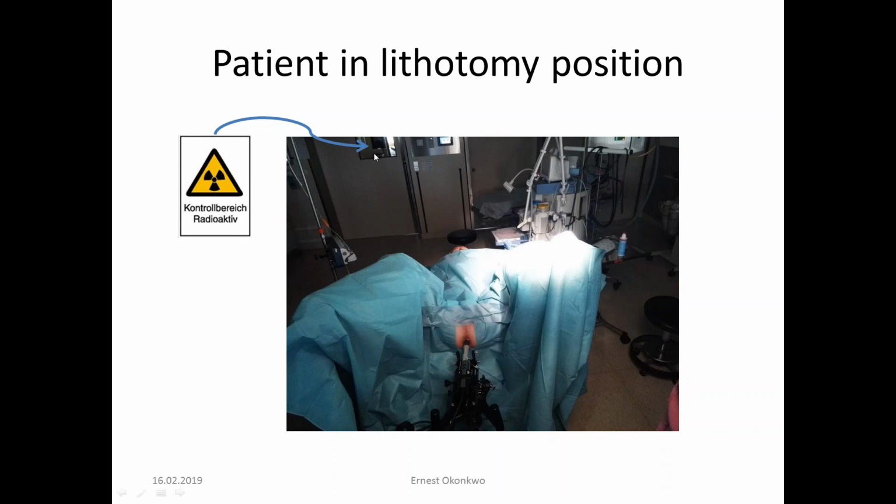So here you see that on the door we place the radioactive sign so that each individual passing by or who intends to enter the operating room is aware that the area is a radioactive control area. Here is the probe, the ultrasound on the stepper.